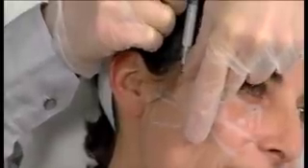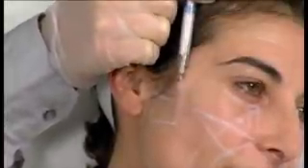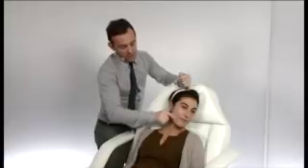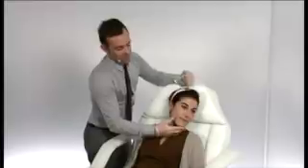Okay, you see that I'm continuing my fanning, and I'm actually putting in a lot of different strands of Radiesse, and they have been very deep on this side. Something I forgot to tell you about this alar tragal line, because above that line, I inject on the periosteum, and below that line, I inject subdermally or intradermally. This is actually a rule of thumb because there's a few exceptions.